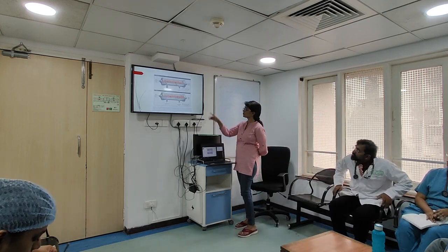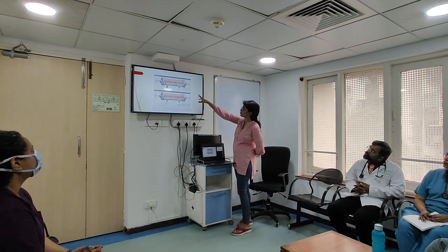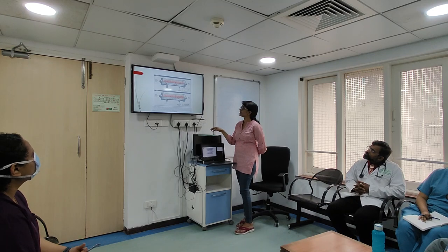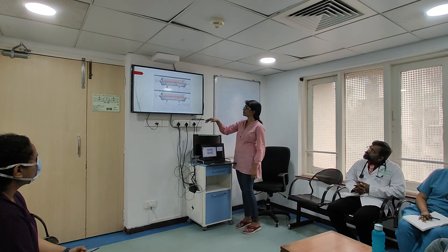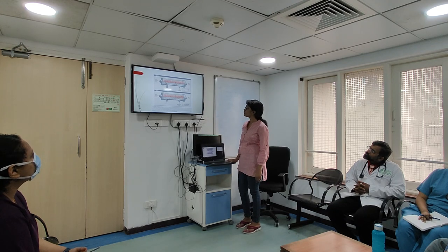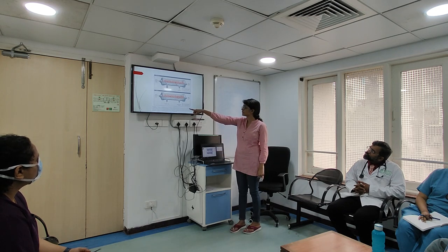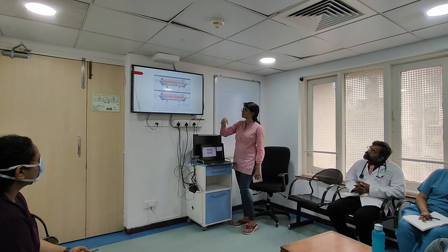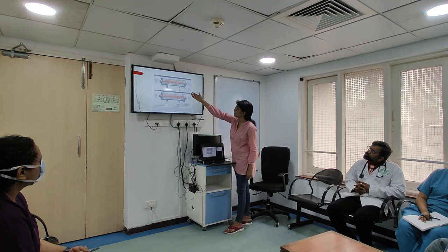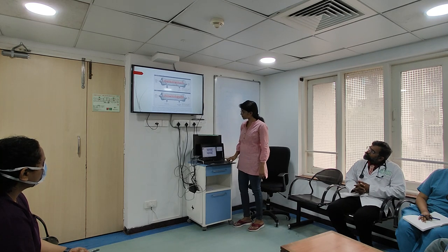We will understand this by the two diagrams. First, in convection, there is a pressure gradient. The low molecular and middle molecular weight substances along with the water will go to the opposite side of the semi-permeable membrane, and the ultrafiltrate will be removed. Second is diffusion. In diffusion, we infuse dialysate solution, so the filtration occurs along the concentration gradient. The concentration of toxic substances will be higher on this side, and the lower concentration will be on this side. So the concentration gradient will be there.